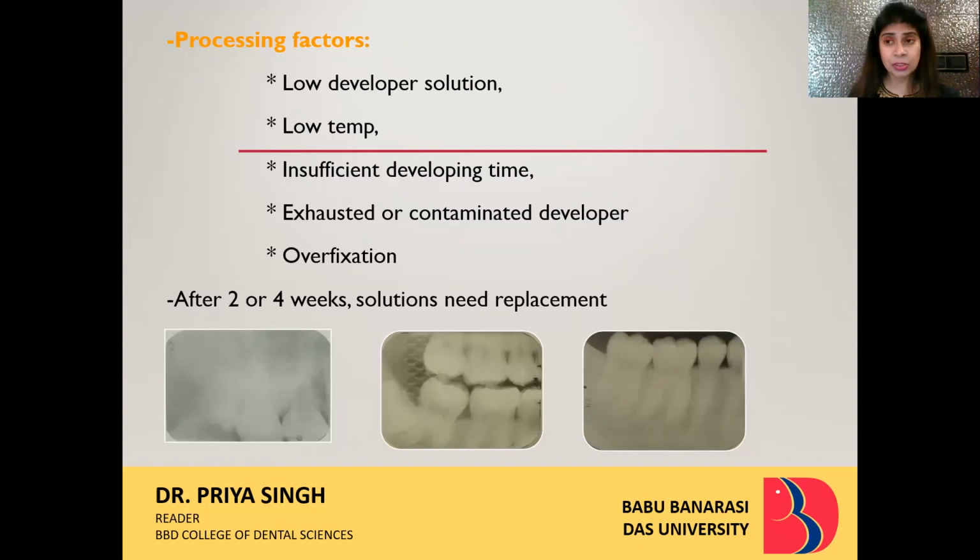The developer solution might be low in concentration. The temperature of the solution might be low. Insufficient developing time might be given while processing. Exhausted or contaminated developer might be there. Over fixation can also lead to processing errors. So after 2 or 4 weeks, the solution needs replacement.